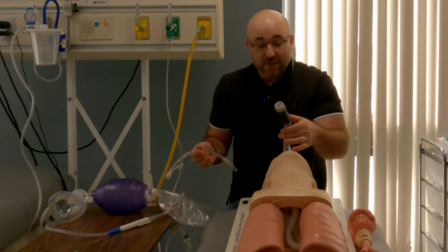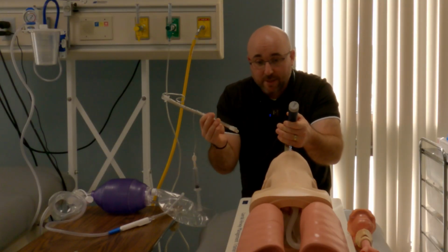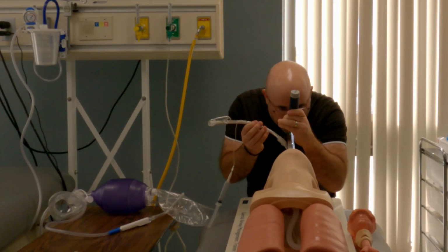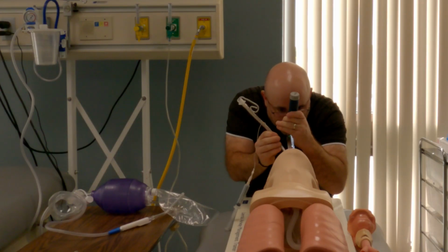So I'm going to ask for the endotracheal tube. I'll say suction. Then I'll say, hand me the endotracheal tube. I'll look like this. I'll find the glottis. And I'll be like, oh, I'm having trouble finding it now. Okay, there we go, I found it. I'm going to insert.